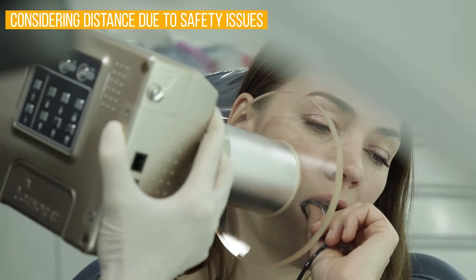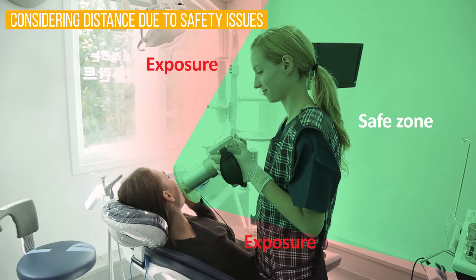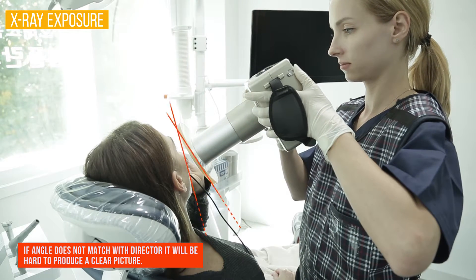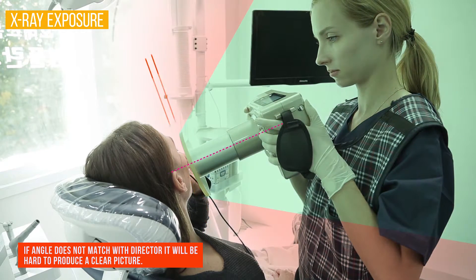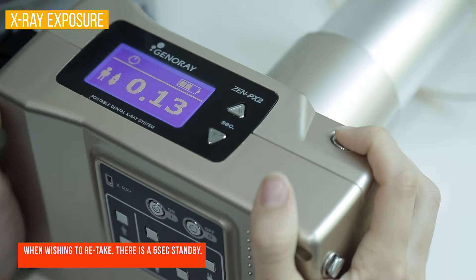Expose while referring to the screen, which explains that distance matters when exposing and should be taken into consideration. Direct equipment towards the area you wish to expose, making sure the equipment's angle matches with the direction.